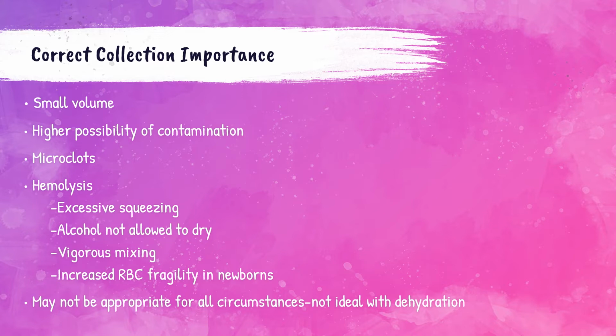Also, again, dermal punctures are the sample of choice for newborns, but newborns' red blood cells are more fragile than in adults, and so they hemolyze much more easily. So dermal punctures are not always appropriate for certain circumstances and are not the ideal specimen for patients that are dehydrated.